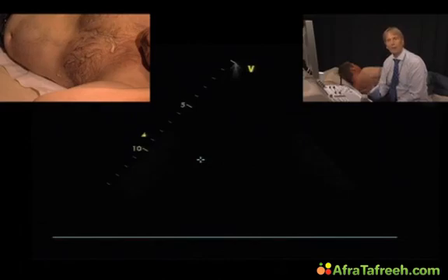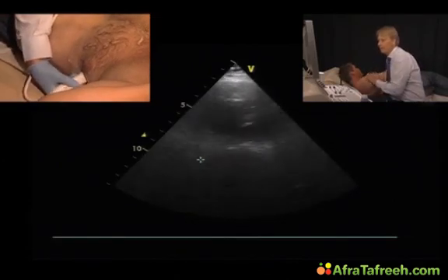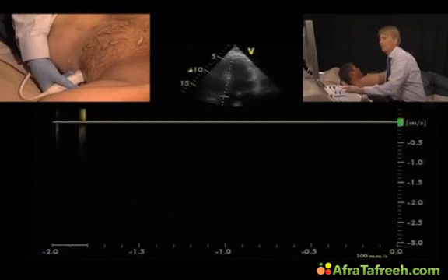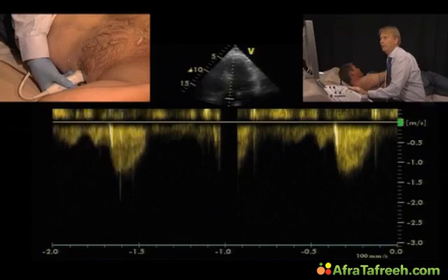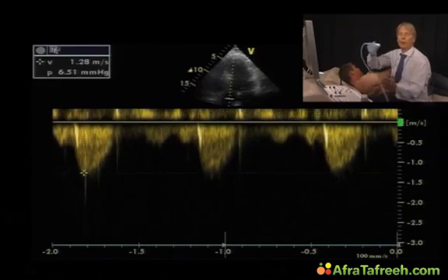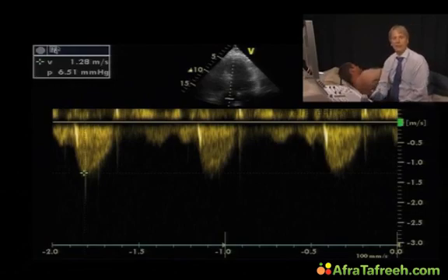So this is indicative that the patient had alcohol ablation of the interventricular septum to reduce the thickness of the interventricular septum and thereby reduce the gradient. And let's take a look if the patient has a gradient. So this is the continuous wave Doppler. And normal LVOT velocity, no gradient, because the septum had been reduced by alcohol ablation.